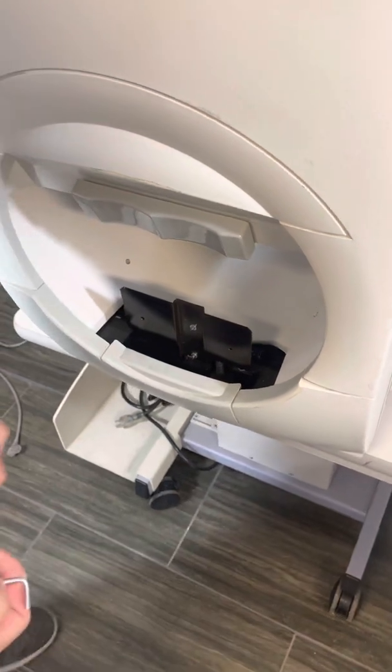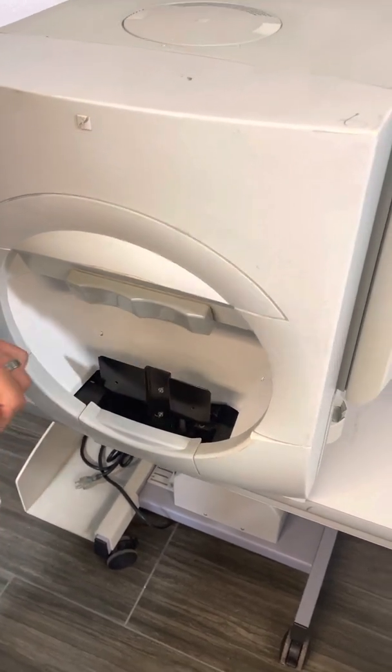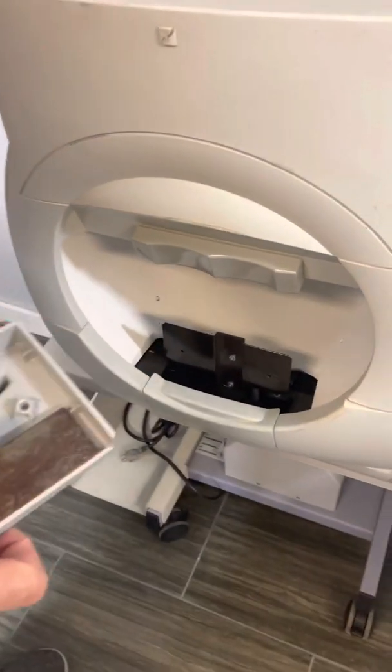If anything falls down in the bowl, you can refer to our other video for the lens holder to be able to remove this cover and get whatever is needed. Or if you can't get that off and you need to be able to get to the back side.